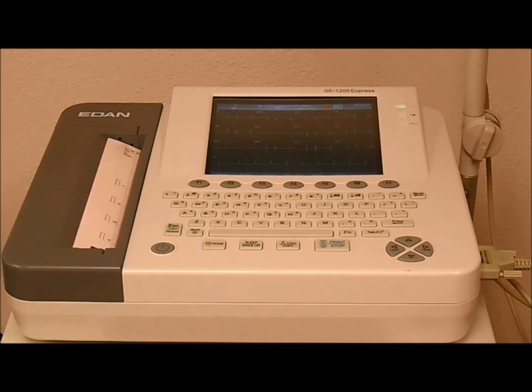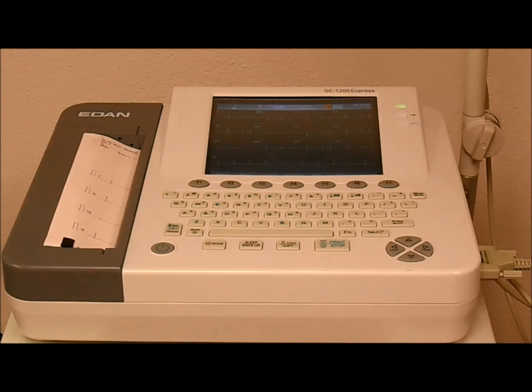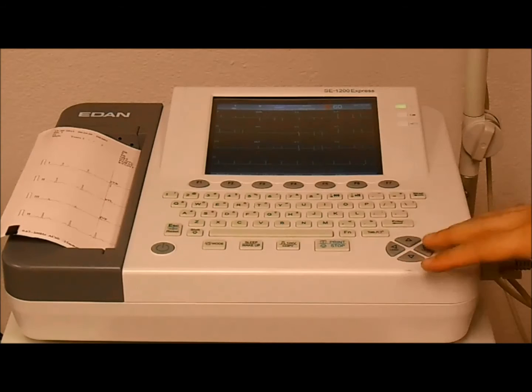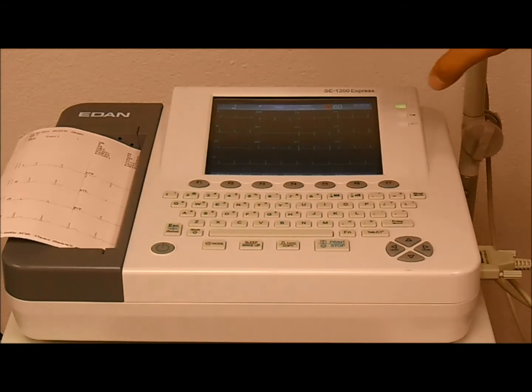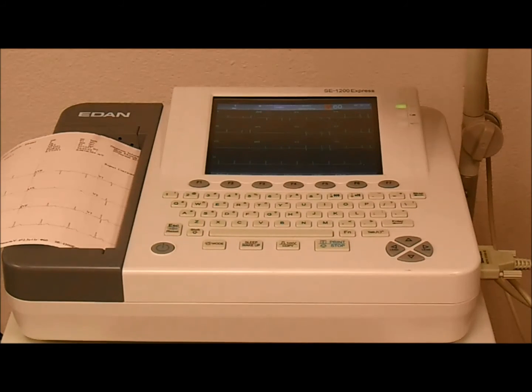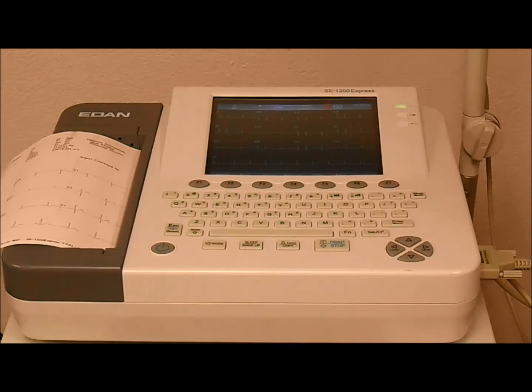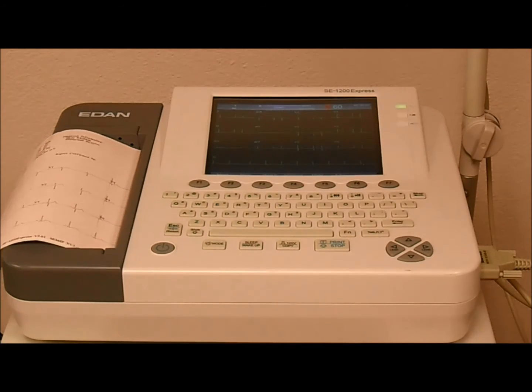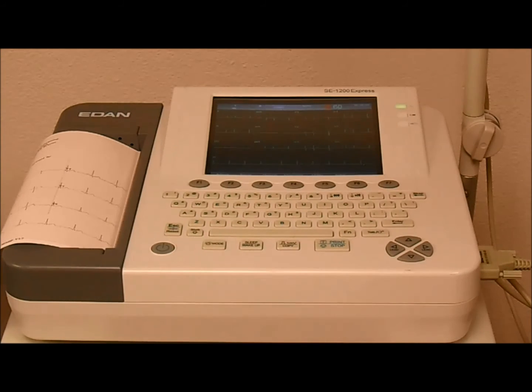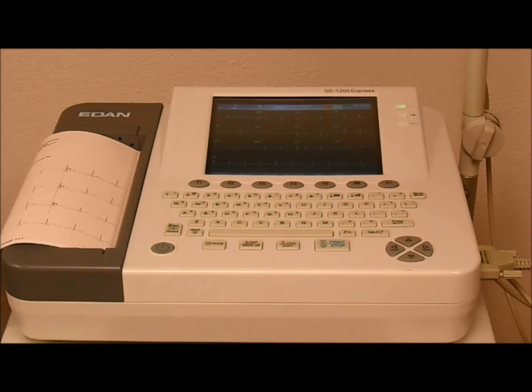So it's that simple. In the report we get all the leads, we get the patient information, we get the measurements, and the interpretation. That's the beauty of the EDAN EKG. It's a very simple operation.